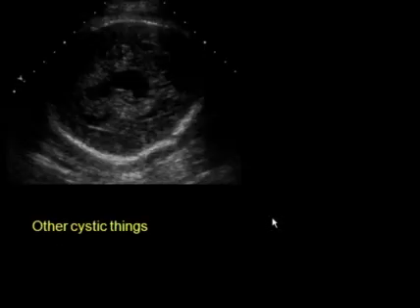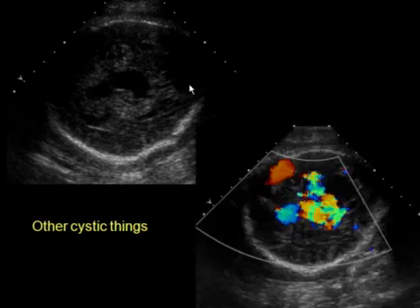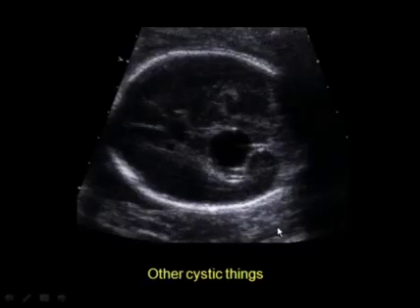Remember that everything cystic in the brain is not a normal variant. In this case, we have an irregular fluid collection that's right in the midline, but has a curved shape to it and possibly some extensions out of this shape. And don't forget to turn on the color Doppler in this instance, because we see that this is a large vein of Galen aneurysm.